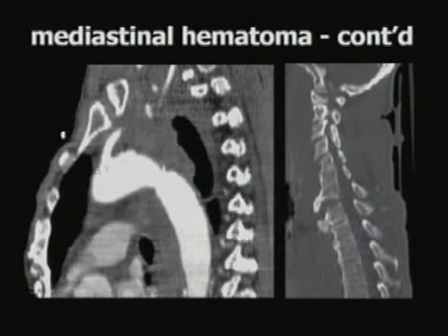So I came up with this sagittal image, and I saw that some of the active bleed was actually occurring quite remote from the aorta itself. The great vessels actually looked okay. But what I saw in the cervical spine was this small little extension injury, but these large hook osteophytes. And the best guess that we could come up with, and so far the one that's holding to date, because we have no autopsy, because the patient survived, was that some unnamed vessel got pierced against those osteophytes and was actively bleeding. So mediastinal hematoma is a great marker for flagging your radiographs as being abnormal, but without your direct signs, it often does not pan out.